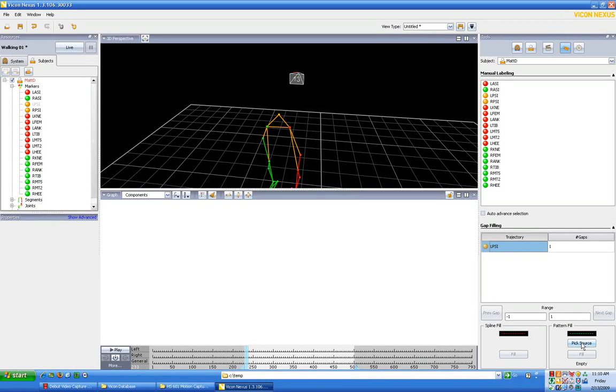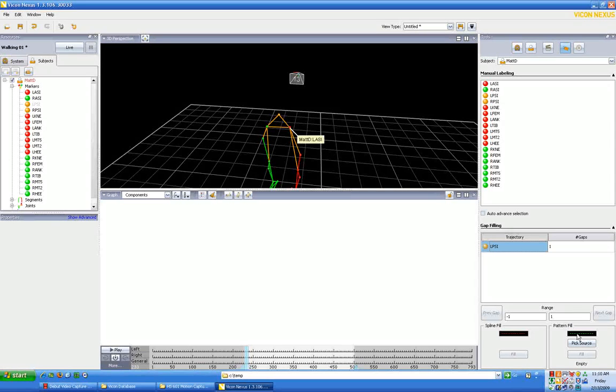In the case of larger gaps, you really want to use pattern fill. What pattern fill is going to do is it's going to use one of the other dots on the same segment and evaluate the pattern of movement of that dot and apply that pattern to the other dot. I'm going to show you how both of these would work.